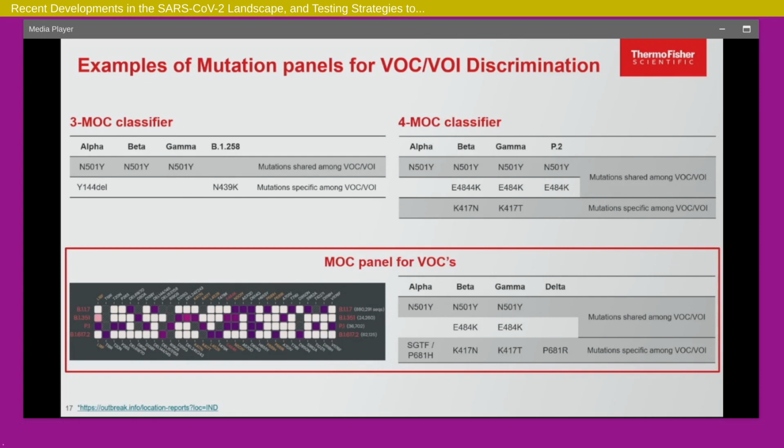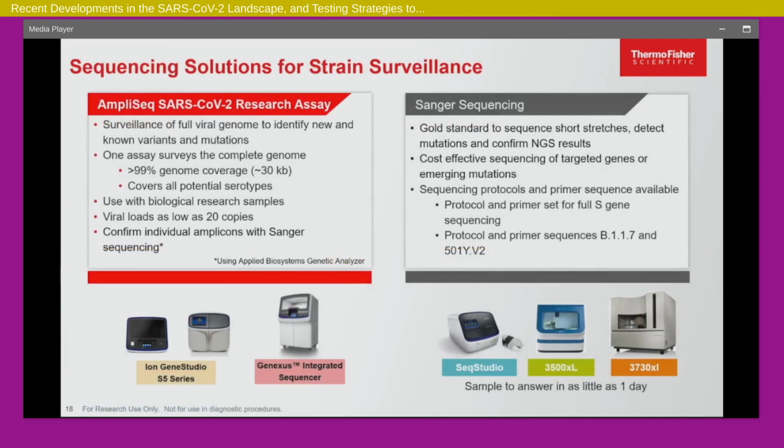The other thing you can add is how much redundancy do you want built in your assay. So some people like at least 2 assays to identify a variant. Some people like 3 assays to identify a variant. So based on that, you can devise a panel and run it on the same instrument with the RNA that is already there that you extracted for PCR, regular diagnostic testing.